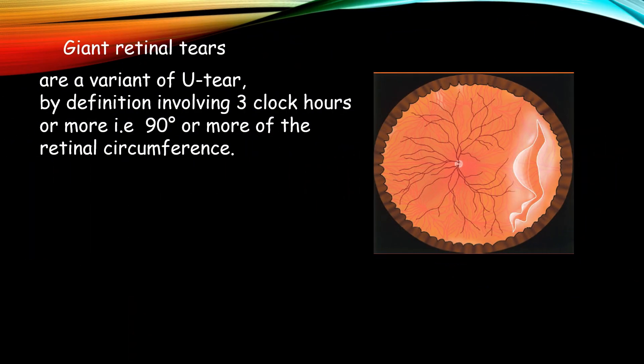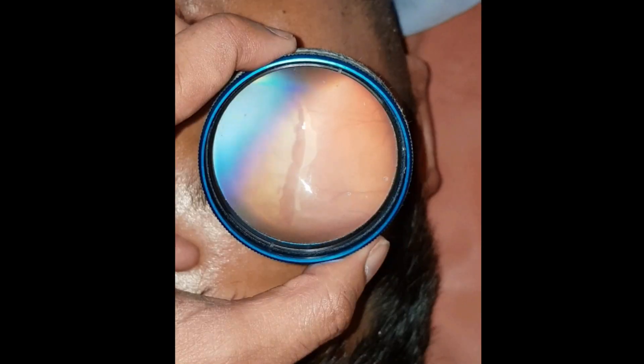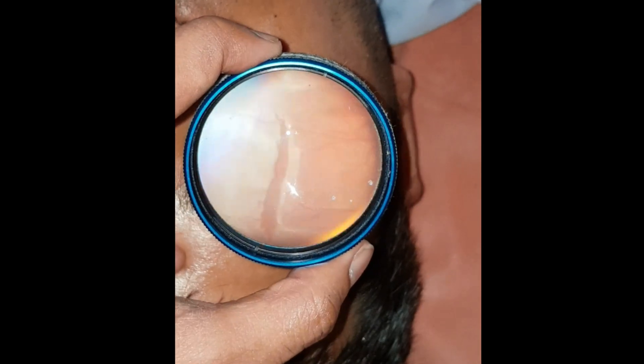Then we have the giant retinal tear, which by definition involves three clock hours or more of retinal circumference, that is 90 degrees or more. This is how it looks — a temporal giant retinal tear in a young male post blunt trauma.